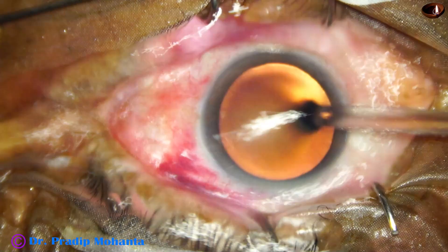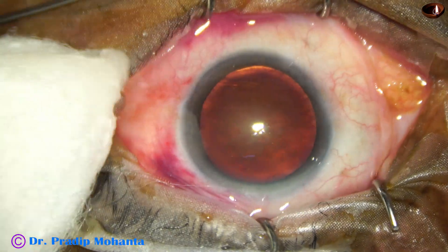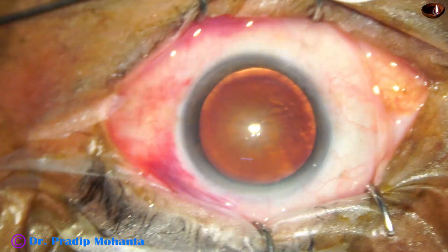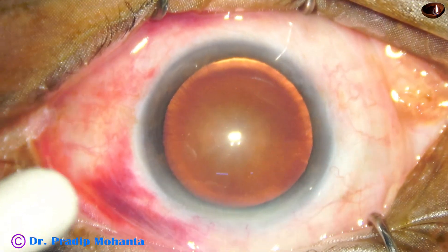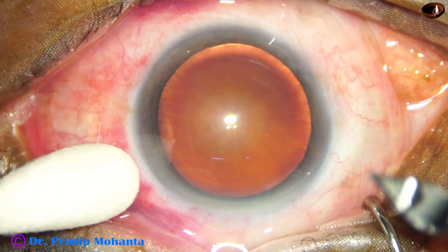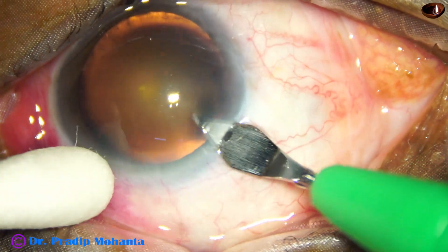The ocular surface is thoroughly irrigated with BSS, applying few drops of povidone iodine. And now the incisions. The main incision is made, in this case, at around 11 o'clock with a 2.8 mm steel keratome at mid-limbus.